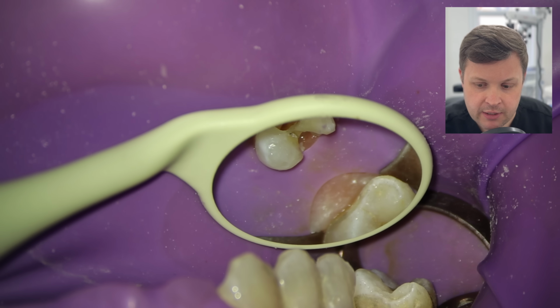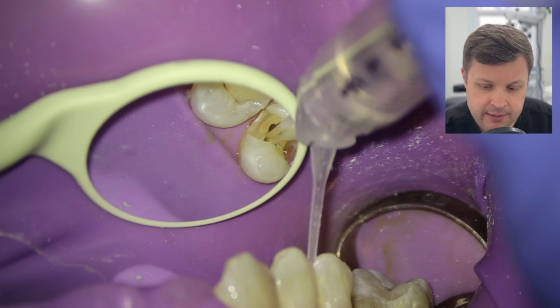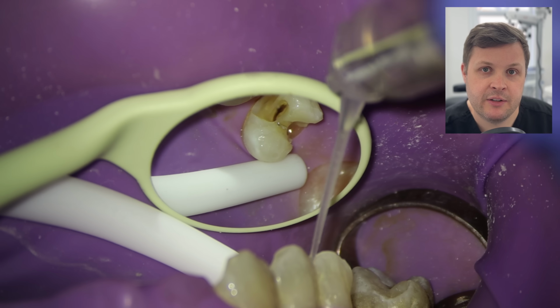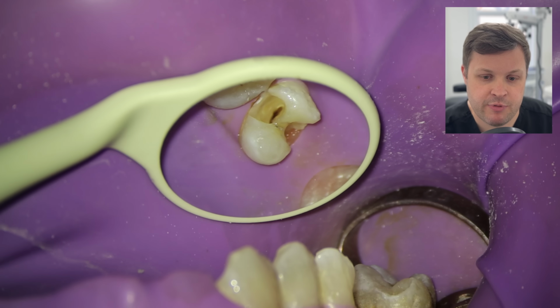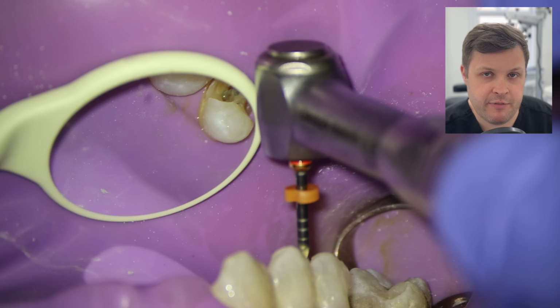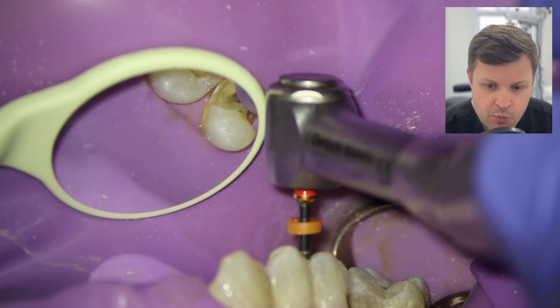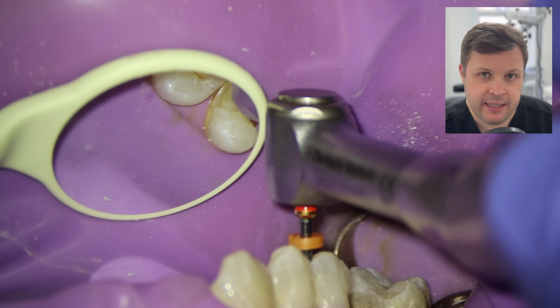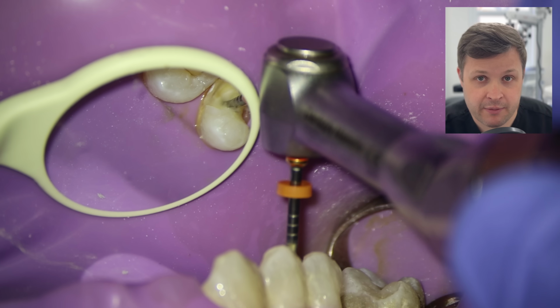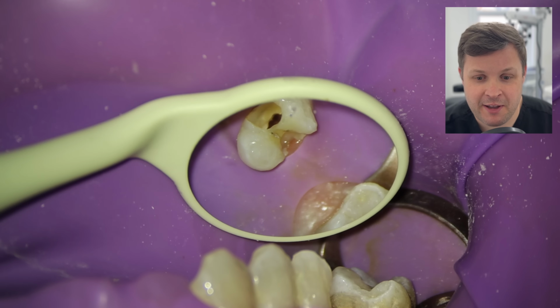So rightly or wrongly, what I try to do is shape the rest of the ribbon canal space here. What I'm doing is trying to rake the rotary file down the palatal aspect of this ribbon shape. Doing these videos, we do a lot of reflection, and I think to myself, is this worth it? But I feel like to obturate this tooth more easily, I should shape it a little bit more and maybe put another GP cone down, and this minimizes the risk of voids.